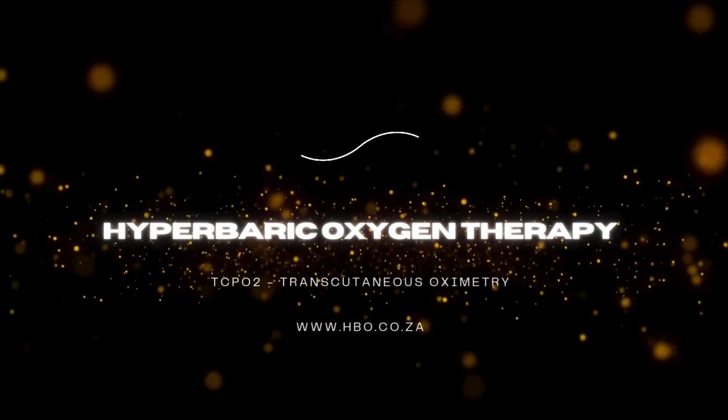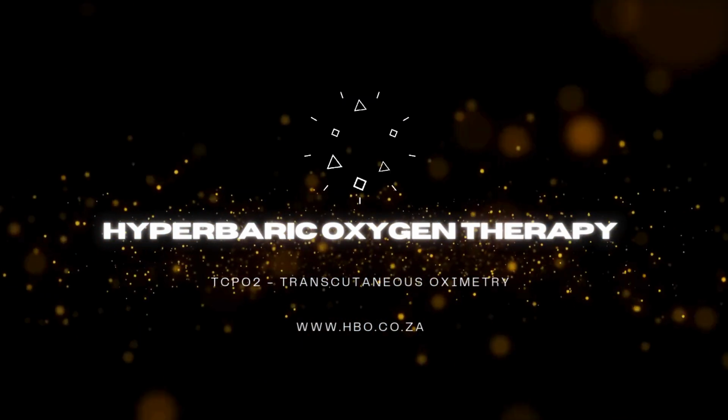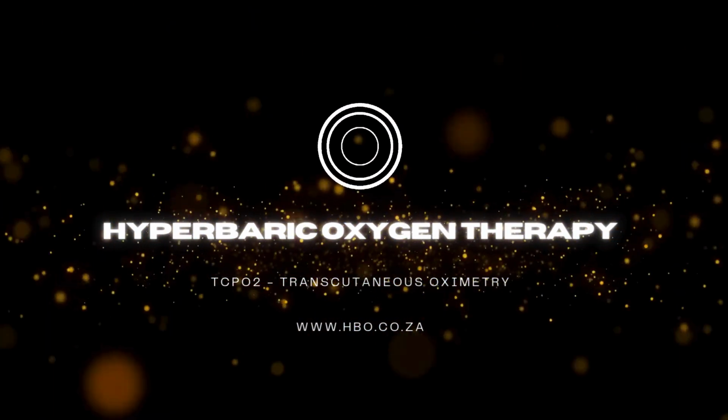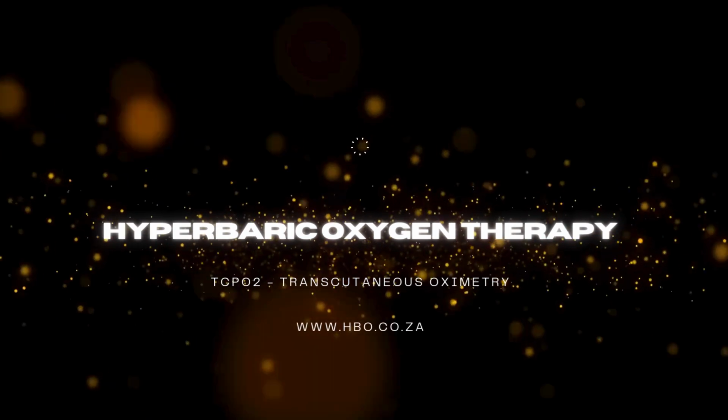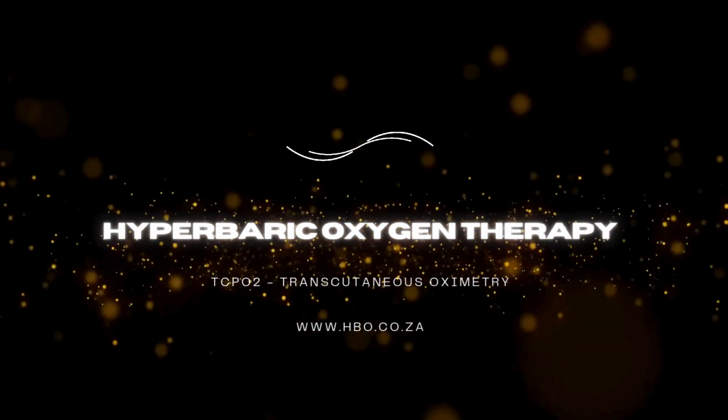Makes sense. For CO poisoning, the main thing you're looking at is carboxyhemoglobin levels, obviously. But TcPO2 could potentially reflect the overall improvement in oxygen delivery to all tissues once the CO is cleared by HBOT. Again, maybe an adjunct measure.